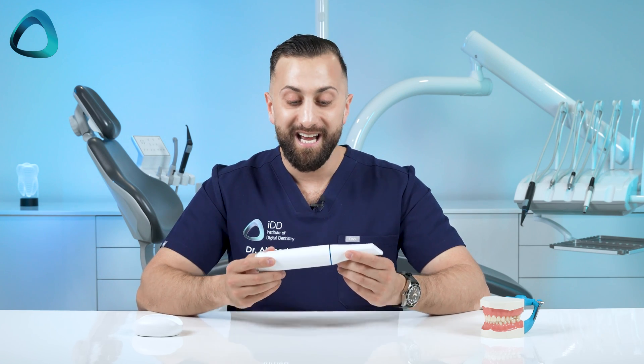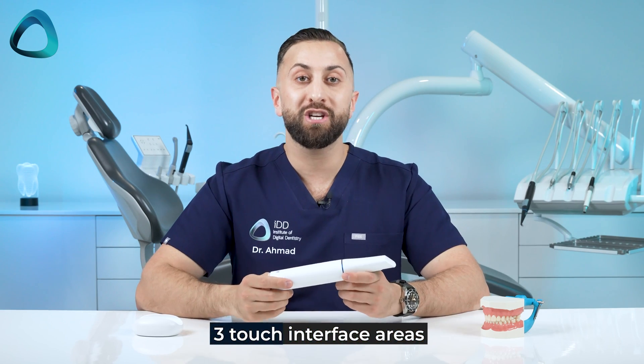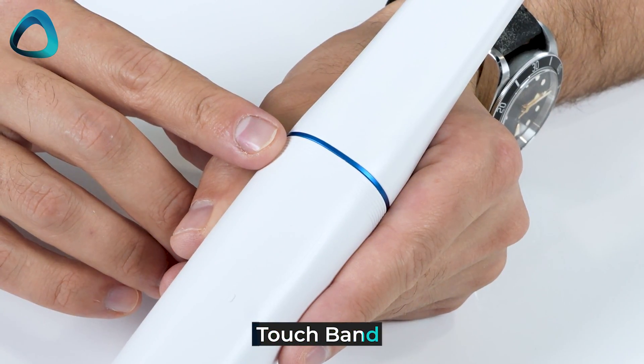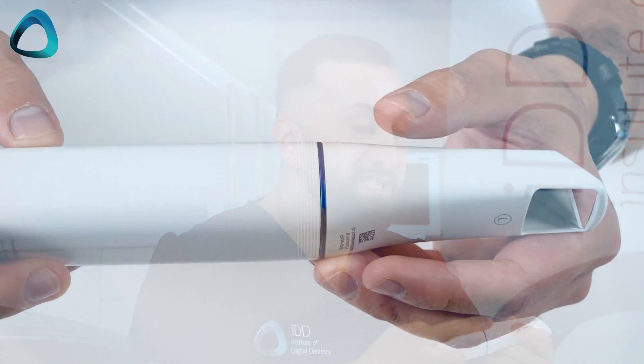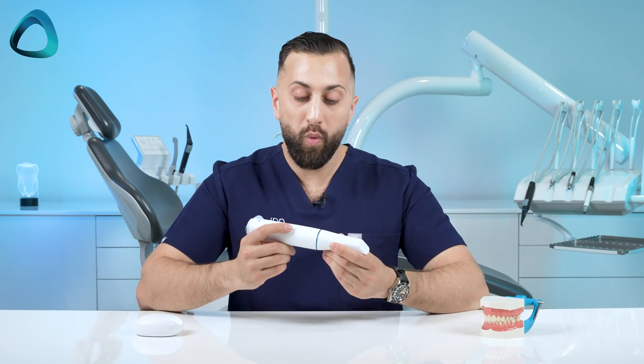You may also notice there are no scanner buttons. Medit have innovated and completely removed any scanning buttons from the i900. Instead, there are three touch interface areas. At the top is the touch band — with one double tap you will start and stop the scanning process. It runs around the entire body of the scanner, so whichever way you hold it, it will be easy to start and stop scanning.